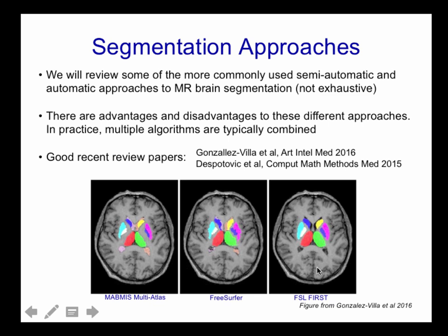So certainly you're going to find differences between segmentation algorithms, and it's all going to end up being trade-offs with computation and time and what you're trying to get in the end, what your final outcome is. And here are a couple of recent segmentation algorithm review papers, if you're interested.